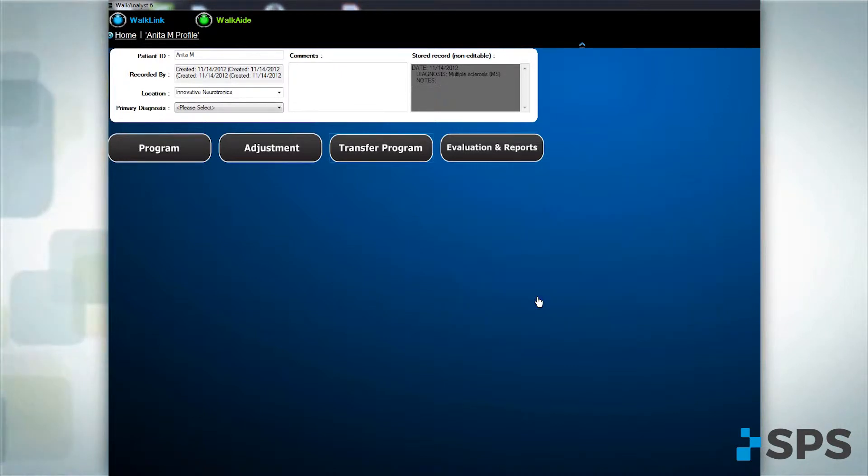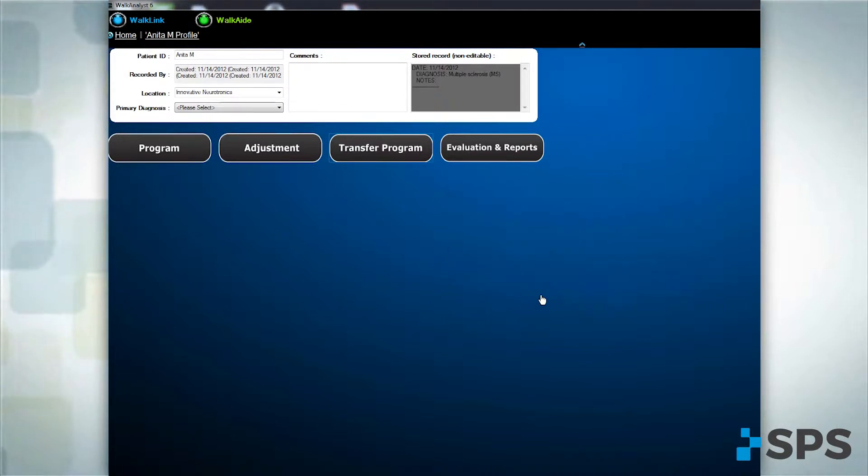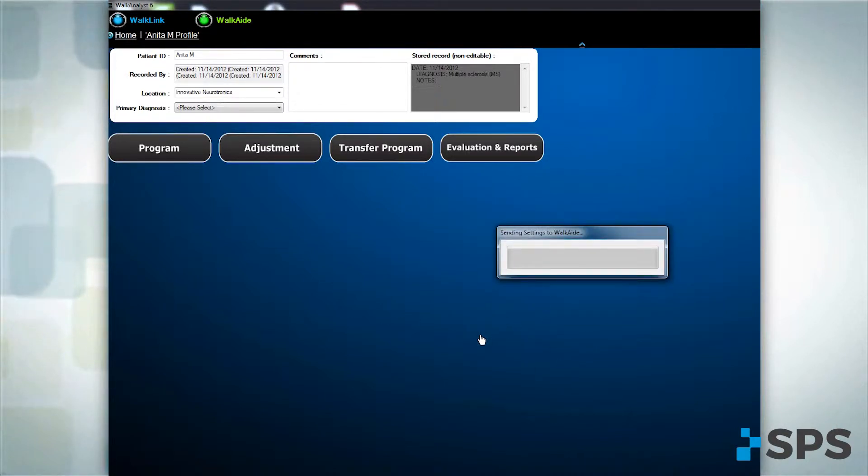Connect the source WalkAid to the WalkLink and press the Continue button. Then connect the target WalkAid to the WalkLink and press the Continue button. This will transfer the settings from the demo unit to the patient's own WalkAid.